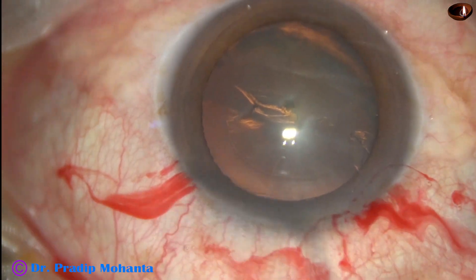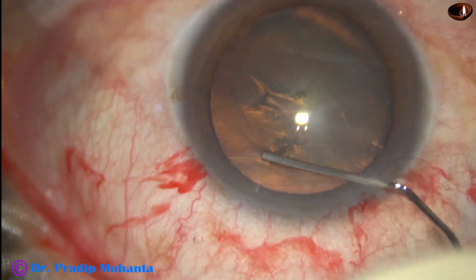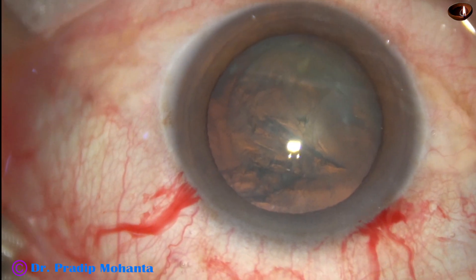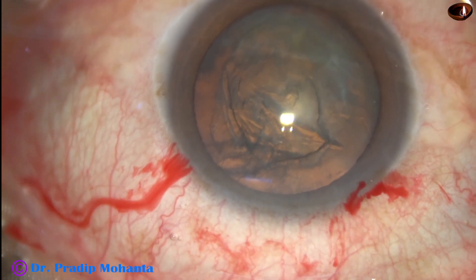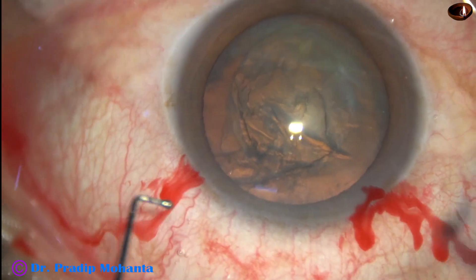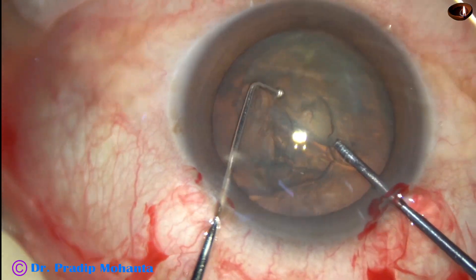Now hydrodissection is done with a 27 gauge cannula and BSS. Now it is very difficult to hold this soft nucleus, so it is better to use a pre-chopper to divide the soft nucleus into pieces.